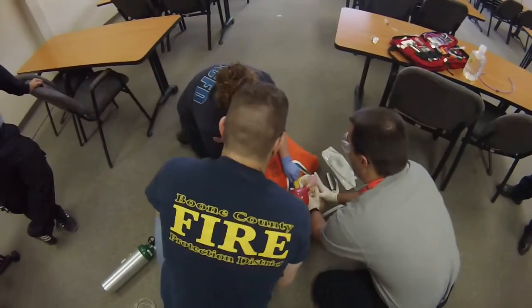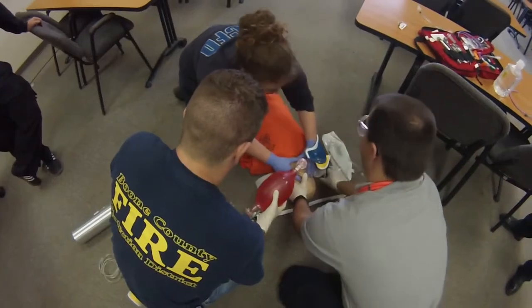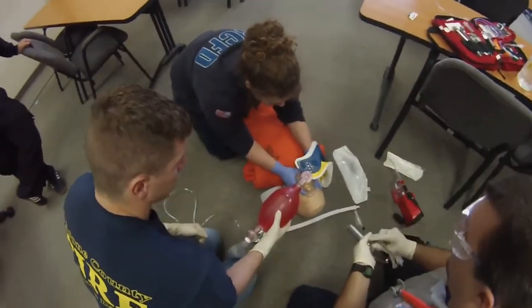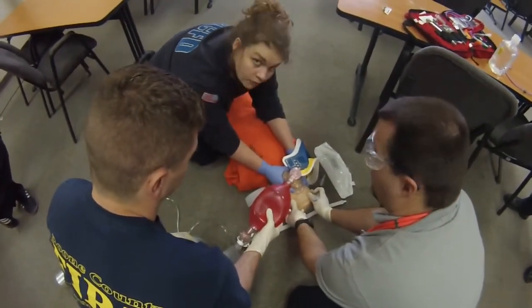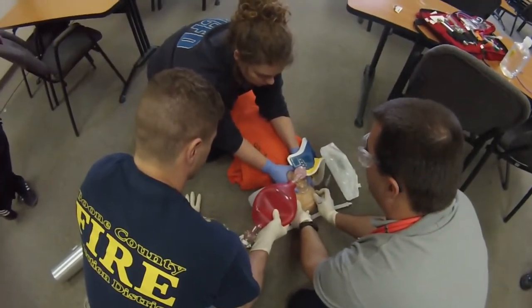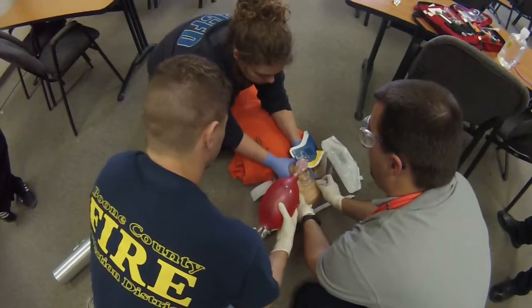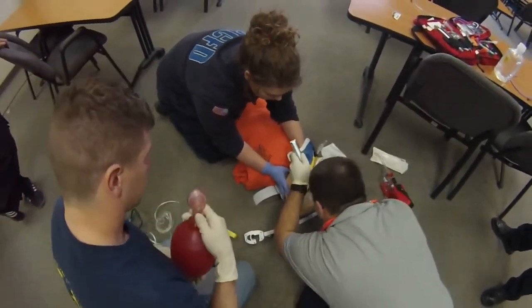I'm going to take the mask. I usually make sure that my helper realizes that I'm going to push against them at this point. She's a medic, so she knows, but if you've got a non-medic, make sure they realize that you're going to try to lift the head up and they need to keep you from doing that. Go ahead. Squeeze. Let go of the mask for the airway. Open it. And we're going to move.